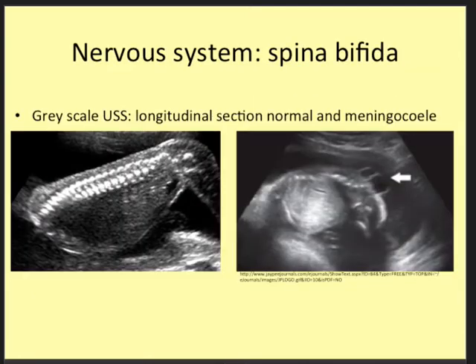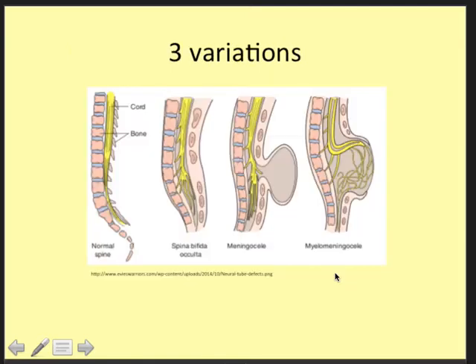In this particular example we will look at also the coexistence of neural tube defect further down. For instance, here are we looking for a spina bifida. The left panel shows a normal vertebral column and nicely closed skin here in the sacral area. Here we see the buttock of the baby, and on the right hand side we see clearly a cystic structure at the level of the sacrum. The sacrum is protruding slightly, and this raises the suspicion of spina bifida, of course, and the meningocoele.